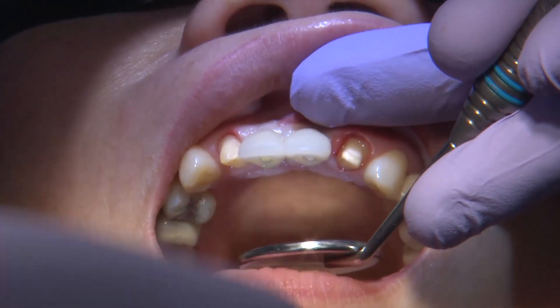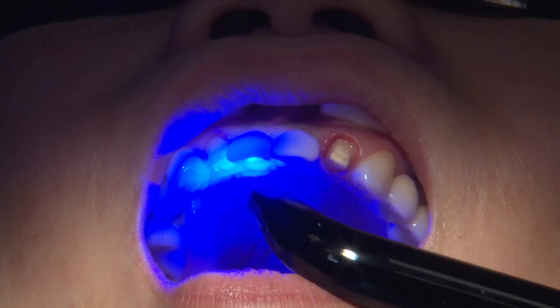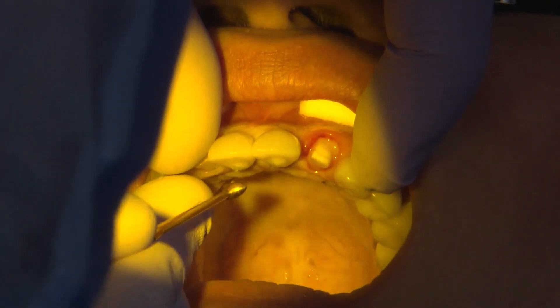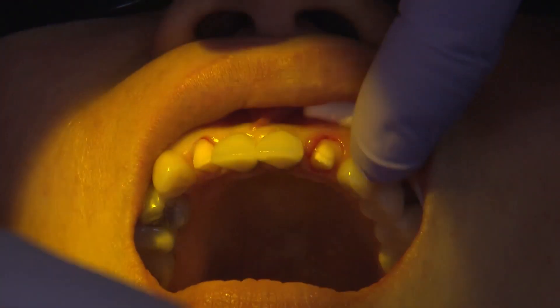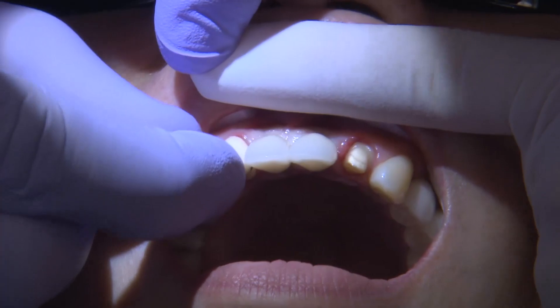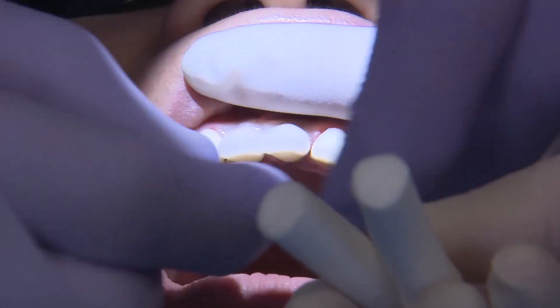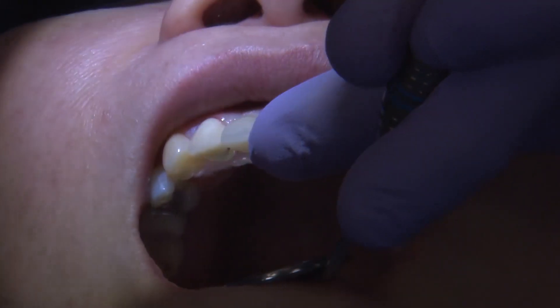I'll go ahead and place Teflon and composite in the lingual screw channels of the implant restorations. Once that is set, I'll take the original biotemps and remove each lateral individually, adjust the contact point, seat them, and temporarily cement them — taking care to remove all excess cement, especially in the areas where the implants have been placed.